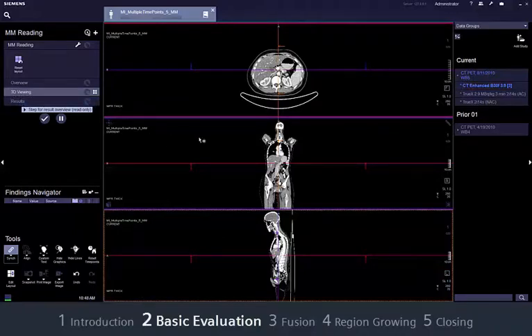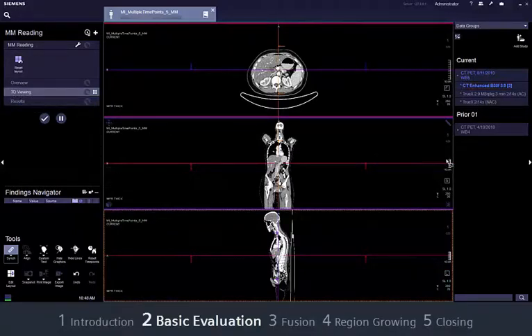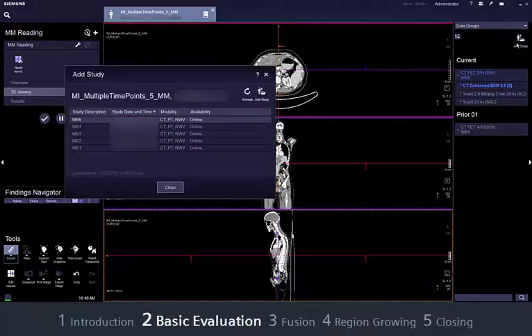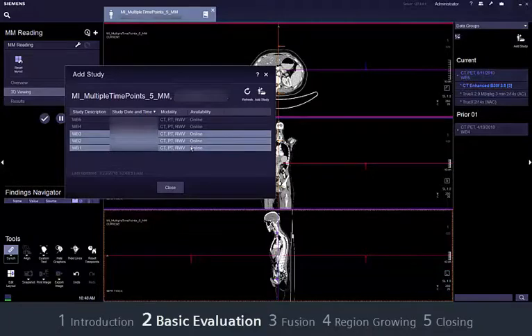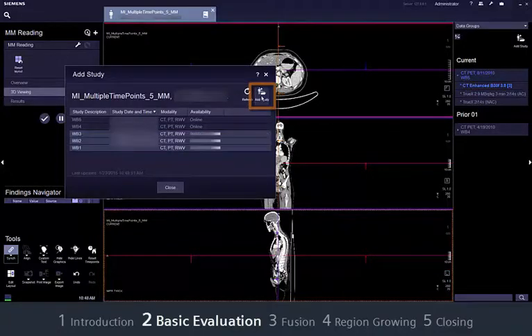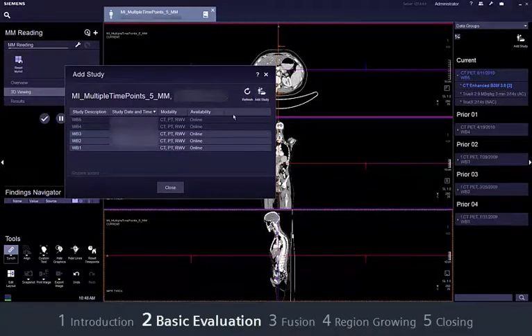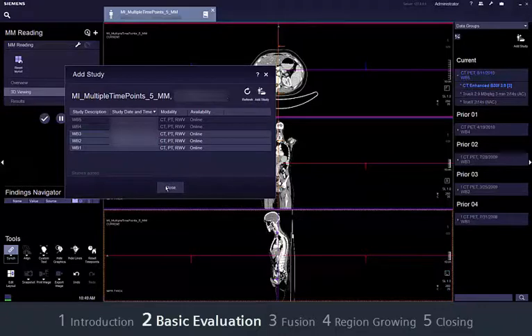The series navigator shows all data sets that are available in Syngo VIA for a specific patient. Additional data of a selected patient can be accessed through the archive. Click Add Study to import further data sets.